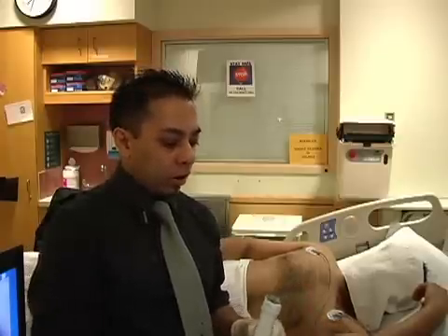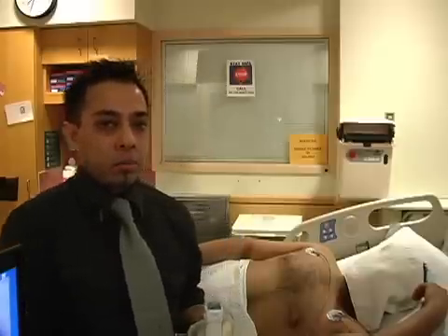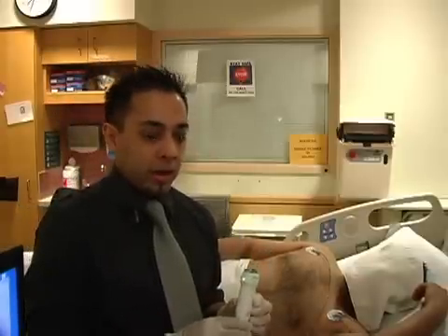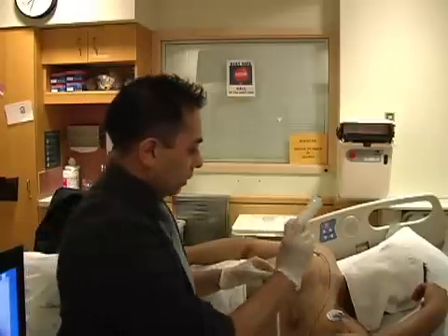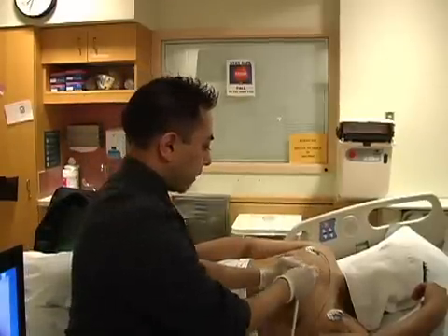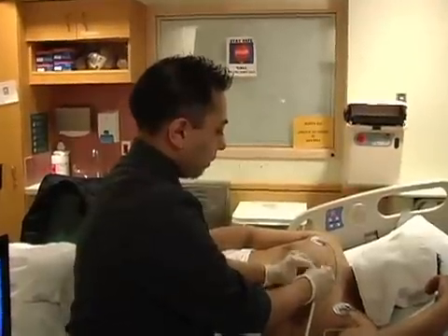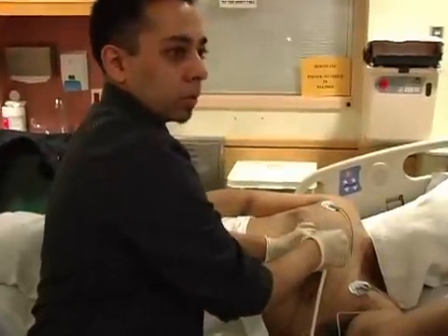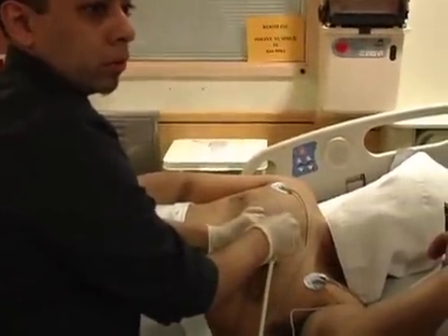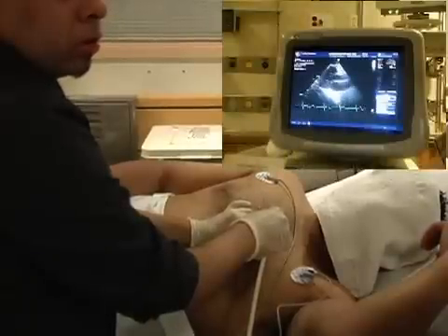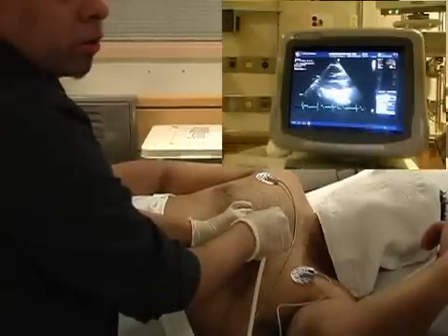Once you have the gel on the probe, you want the marker on the probe — the light in this case — to point towards the right shoulder. You want to be in the third or fourth intercostal space with the light pointing to the right shoulder, and that generally gets you into a view where you see the parasternal long axis of the heart.